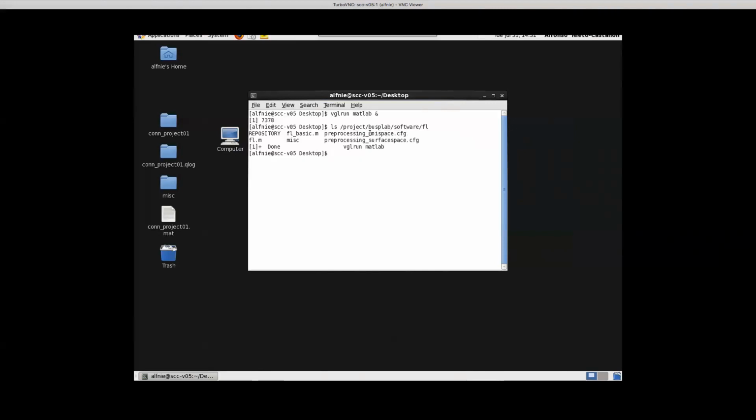I think the bigger distinction for us is having one that is volume based, where you're using, say, indirect normalization along with a warp map, or you're using direct normalization because you don't have a warp map. Right. So of the things that we've talked about, those are the three different things. You may argue... Well, yeah. Just that way, because MNI space could be either one of those two. Right, I see what you mean.